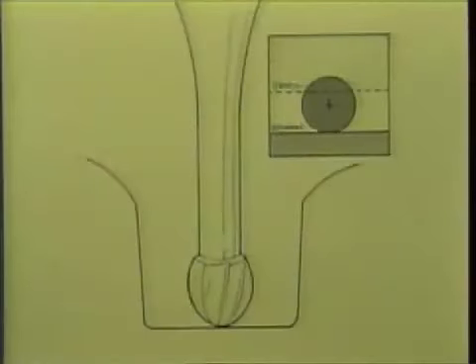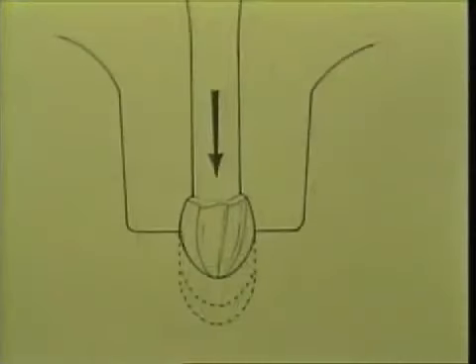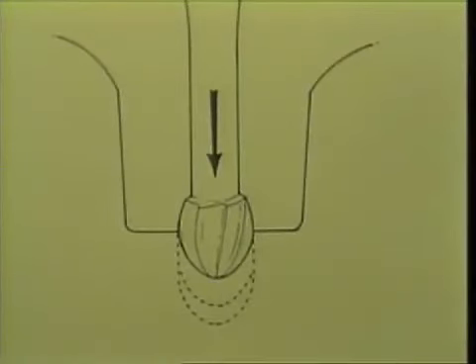The following diagrams will demonstrate the positioning and the proper stroking of the number 2 round burr. The number 2 round burr is placed on the exposed dento-enamel junction as indicated in the upper right diagram. Note that the burr is placed 1/4 on the dentin surface and 3/4 on enamel. Proper depth is usually achieved with 3 or 4 strokings of the burr directed toward the cervical. When the burr has finally penetrated 1/4 to 1/2 millimeter beyond the cutting surface of the burr, it is then withdrawn.